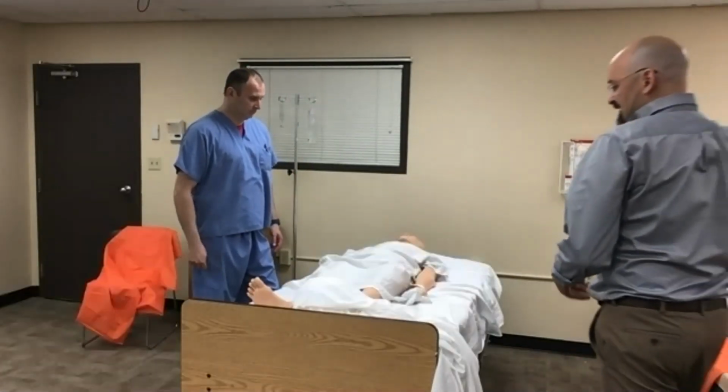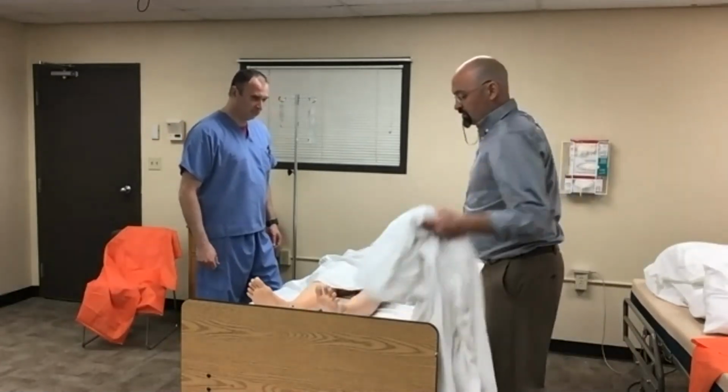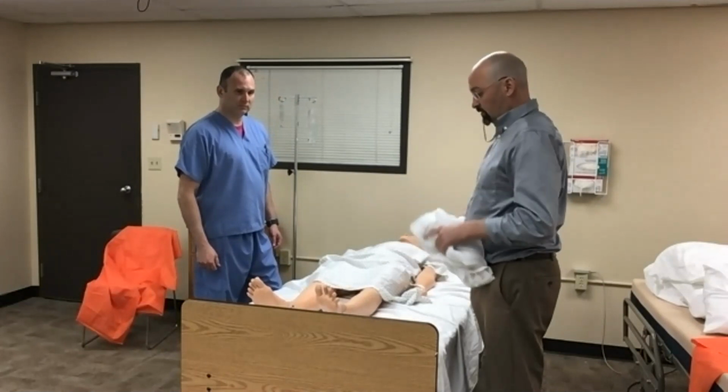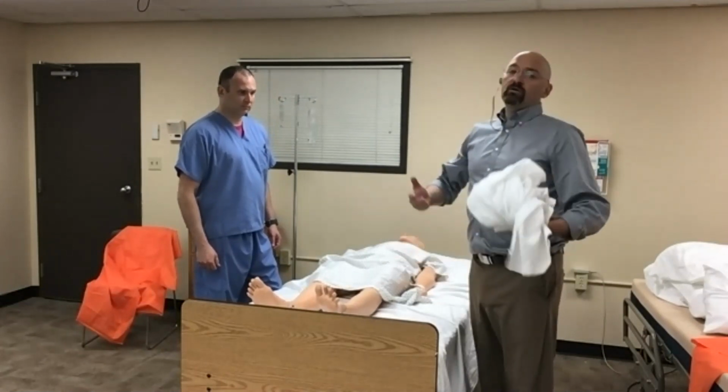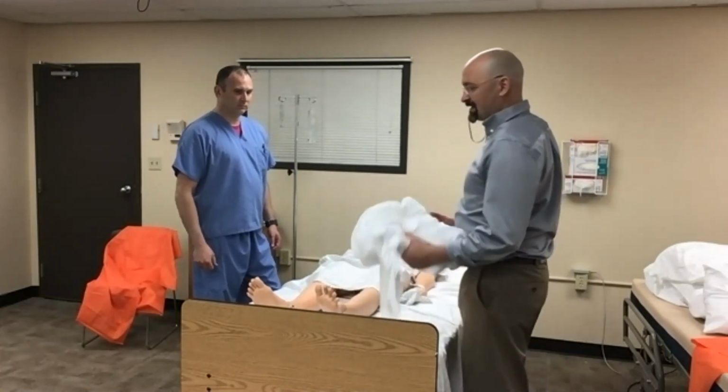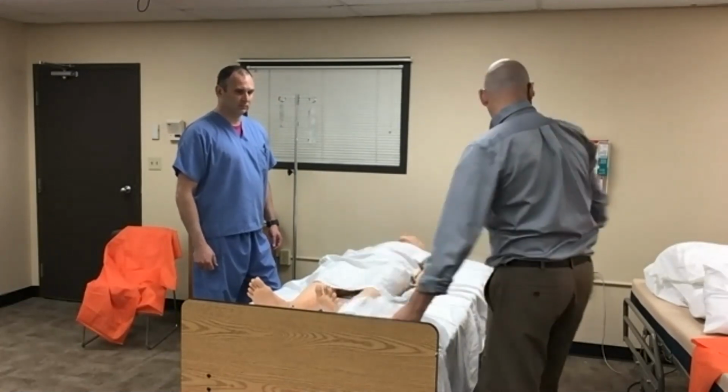So as we had stated, this is a good, better, best approach. So we don't have air transfer devices available. We don't have ceiling lifts available. Your next best option is going to be using slide sheets to prone that patient. So it's going to be a similar technique. The setup is significantly different.